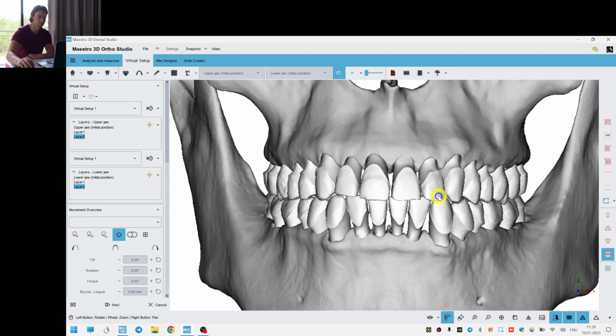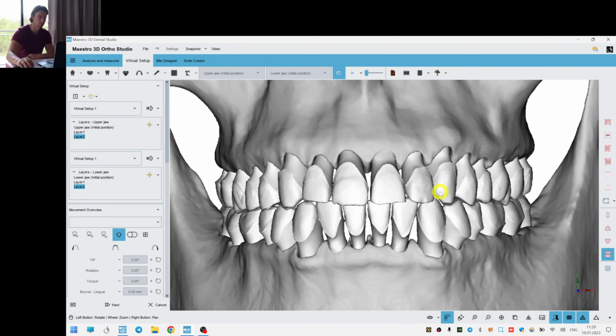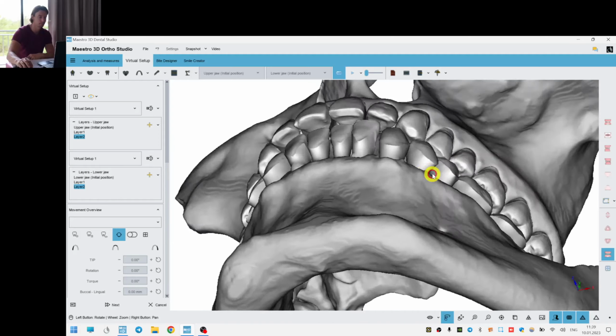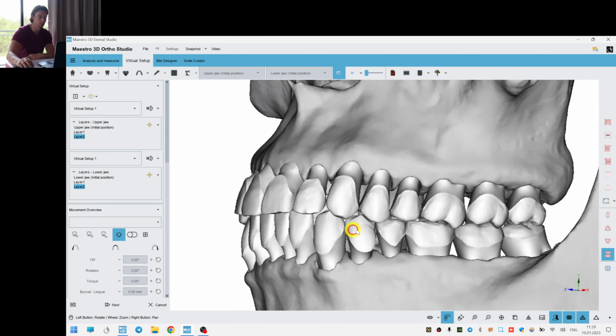Well, and I think it should reduce this inclination. So since I did it at the layer 1, I had to repeat it at layer 2. You can do it by clicking just this reset to position. Restore its previous layer. Well, we're done with the canines and molars and premolars.